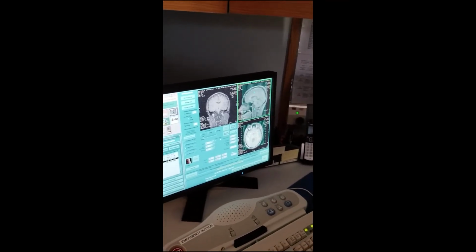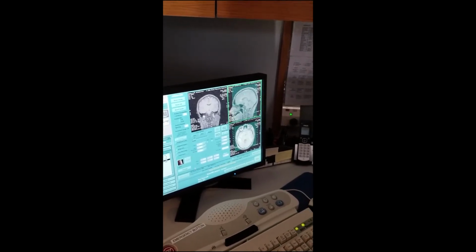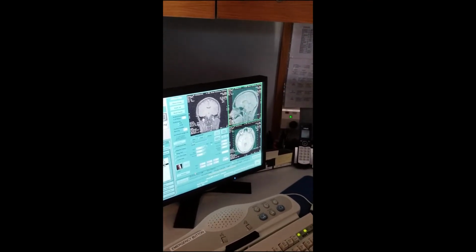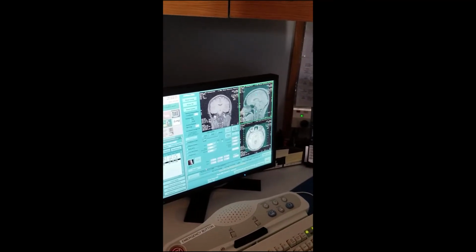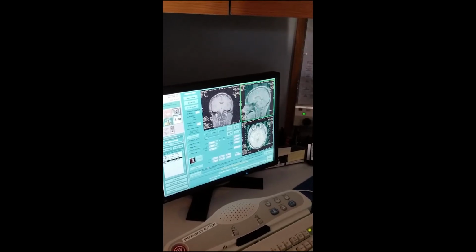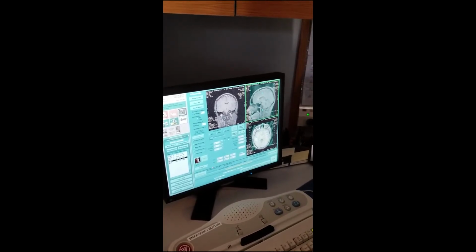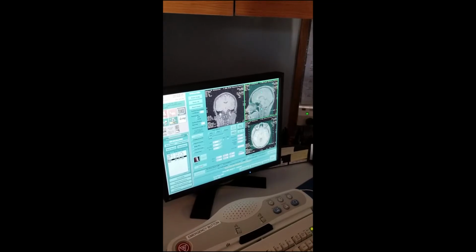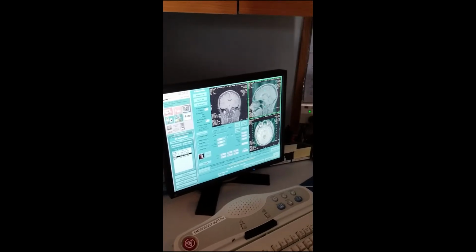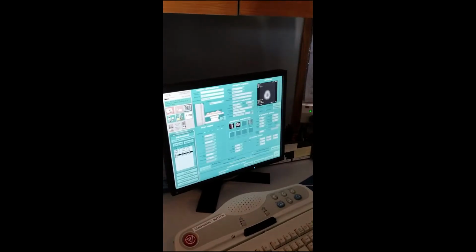Shouldn't we always try to have an odd number of slices? Absolutely not. Whatever you need. The only time you need odd is on cervical, lumbar, and thoracic, because you get one dead center in the cord, one to the left of it, one to the right of it. The odd thing was sometimes you wanted 19 images, so when you filmed, you had 19 and one left to put patient information. But if you need 20, you put 20. If 21 is good, you put 21.